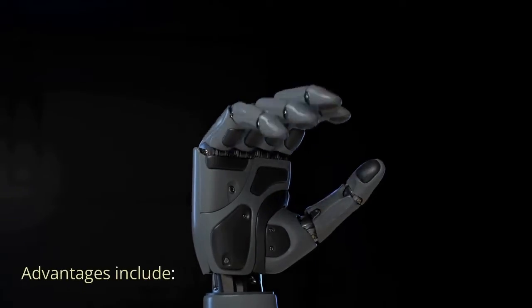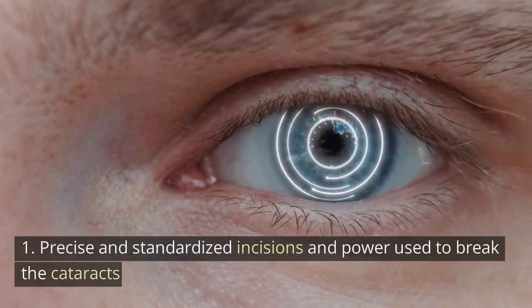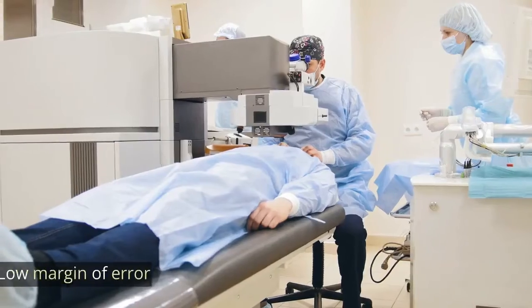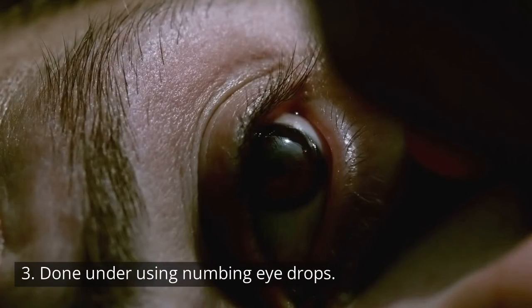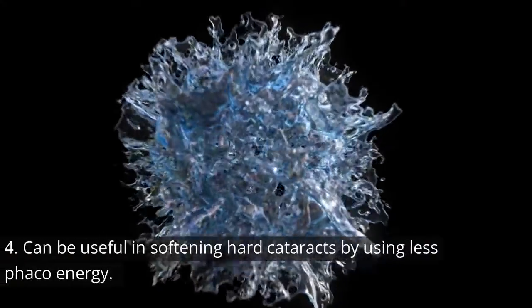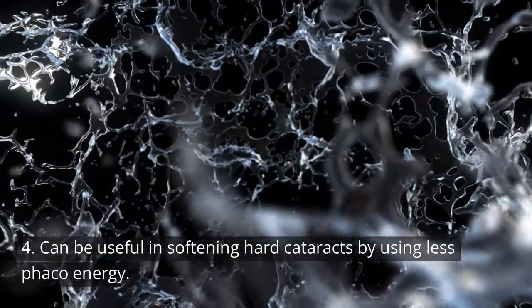Advantages include: 1. Precise and standardized incisions and power used to break the cataracts. 2. Low margin of error. 3. Done using numbing eye drops. 4. Can be useful in softening hard cataracts by using less phaco energy.